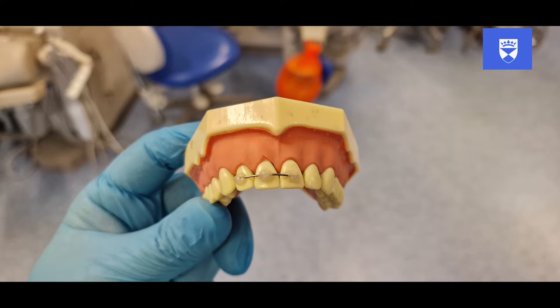This video demonstrates two different methods of how to remove a composite and wire splint. We have previously created videos which demonstrate how to place a composite and wire splint following different types of traumatic dental injuries. We would advise you to review guidelines, in particular the International Association of Dental Traumatology guidelines, when deciding how to manage traumatic dental injuries.